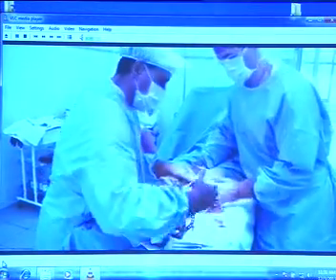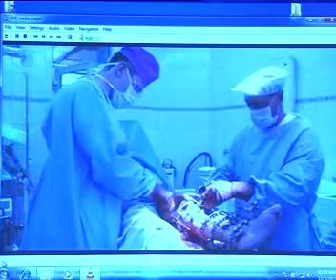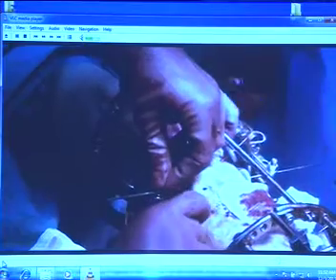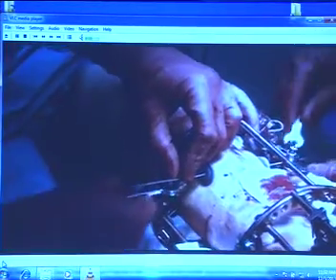The rods are loosened to check mobility of bone fragments at the osteotomy level by rotating the rings, and then tightened to prevent displacement. Additional wires are placed to improve stability of osteosynthesis and prevent secondary displacement during distraction.